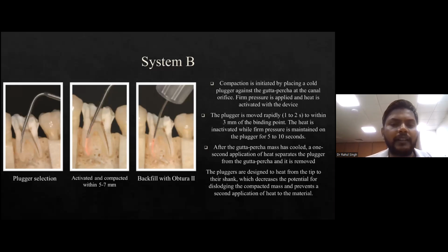Once you heat for 1 to 2 seconds, you press it and then you inactivate, as in stop your heating and then maintain that position for 5 to 10 seconds. Then again start your heating and then remove it. So the excess cone will come along with the plugger.